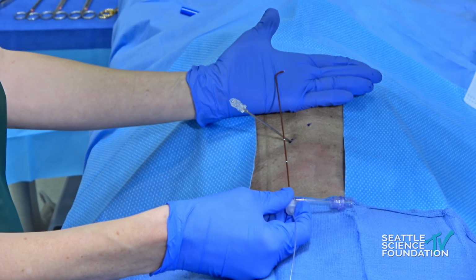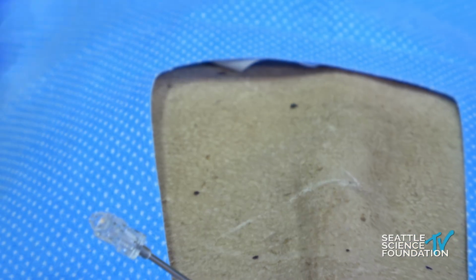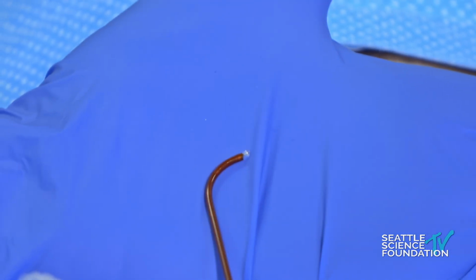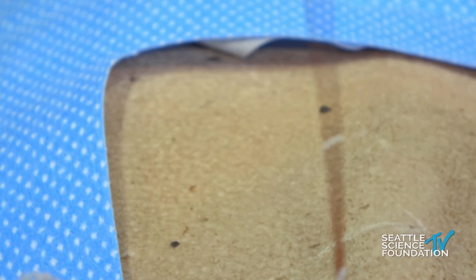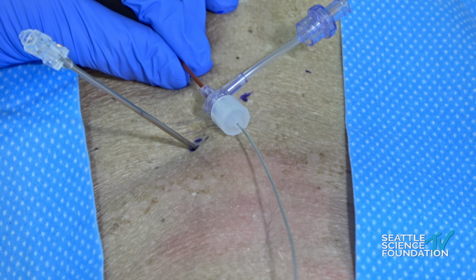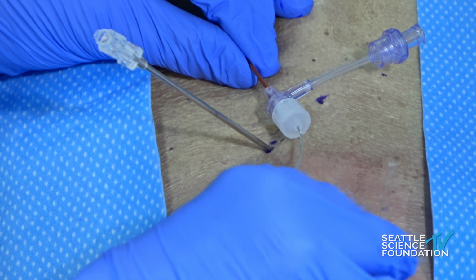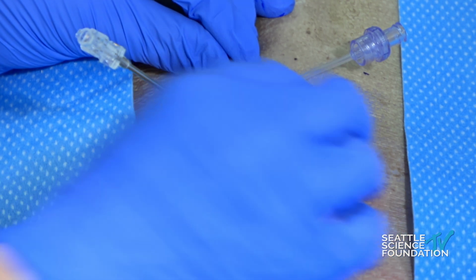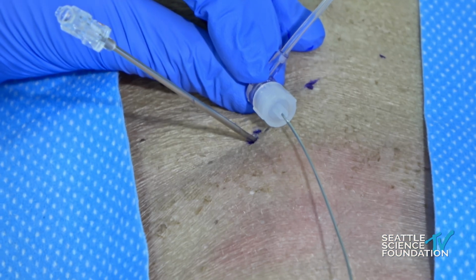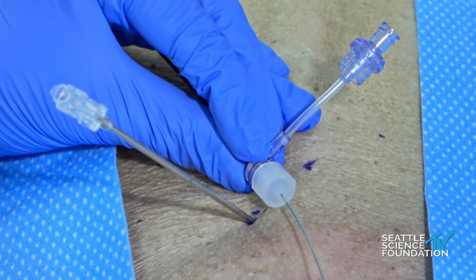introducer. This is my needle with a rigid introducer catheter that has a curvature on the end. You can see the lead protruding from the tip of the catheter, just the little nub coming out the end of it. If you look at this midpoint of my device assembly, what you'll see is the lead protruding from the back. If I curve this around, you can see there is a stylet within the lead. And then this hub here is able to tighten against the lead so that when I push forward, my introducer sheath and my lead will move together.